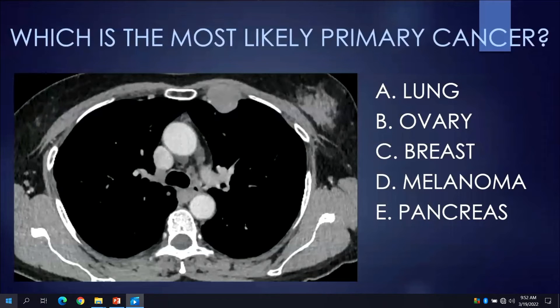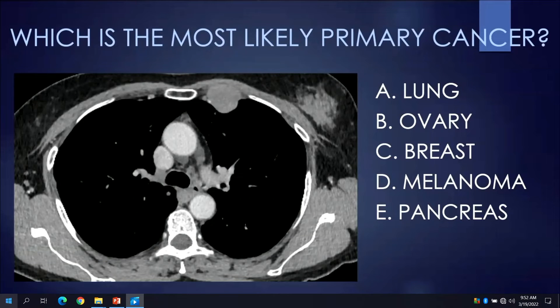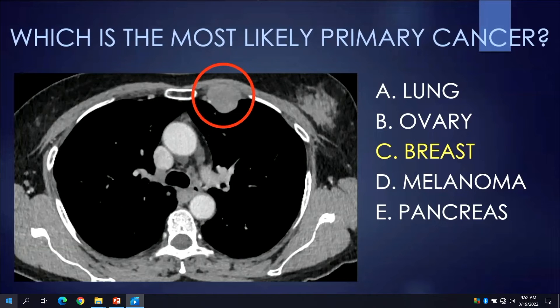Now a multiple choice question: based upon your knowledge of nodal lymphatic drainage pathways, which is the most likely primary cancer causing this enlarged left internal mammary node in a 58-year-old woman? Is it lung, ovarian, breast, melanoma, or pancreas? In this particular case, the left internal mammary nodal metastasis is from the breast. And as some of you may have noticed, there is asymmetric soft tissue in the breast, with that area representing the primary breast cancer.